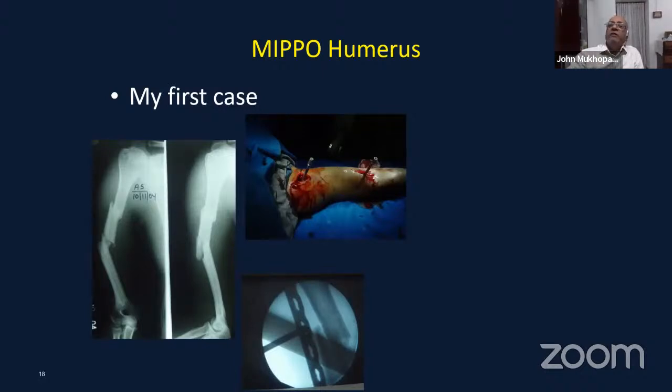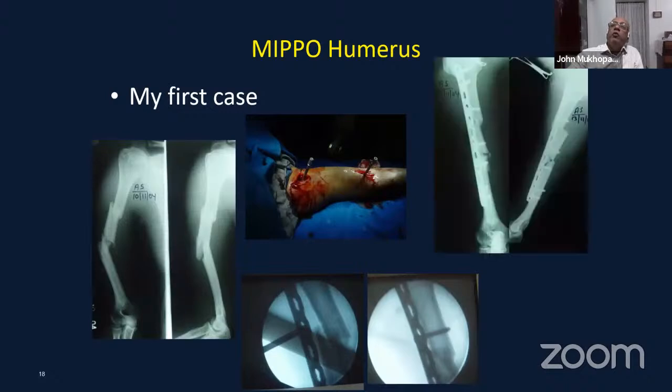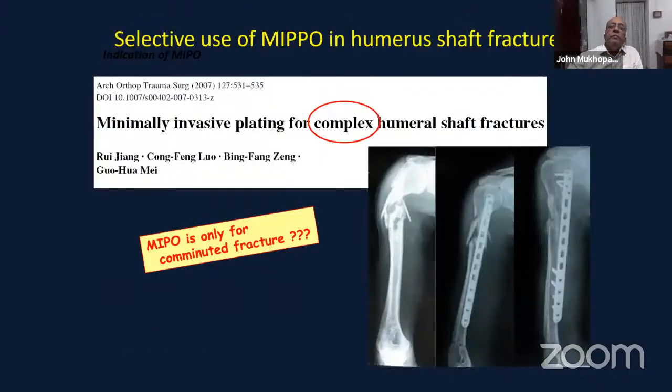So even though the fracture was very displaced, you use a conventional screw to pull the fragment into place and get a reasonable reduction with a bridging type of fixation, although we have one screw in the middle fragment. And you can see how this has gone on to heal well with good function.